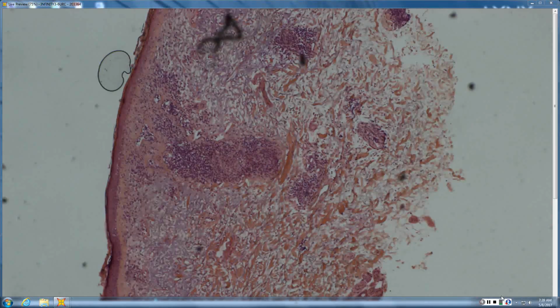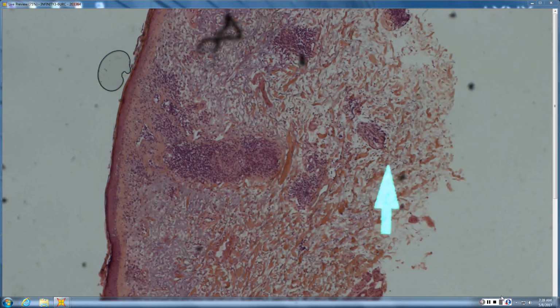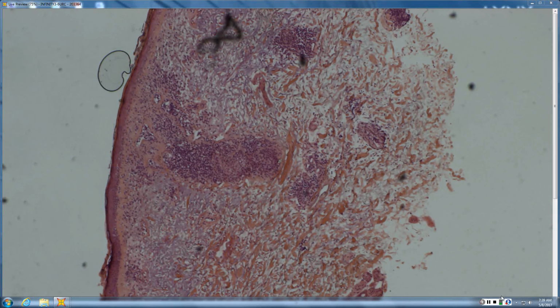Oh, you're talking about... Is that a corner in the middle? No, not corner. Okay. But if you looked at the lymphs, what's their orientation? North and south, I would say. Yeah. Related to what's in the center there? A follicle. So vertical column of lymphs related to a follicle is usually lupus. Yep, you got it. Now you start looking for other things.